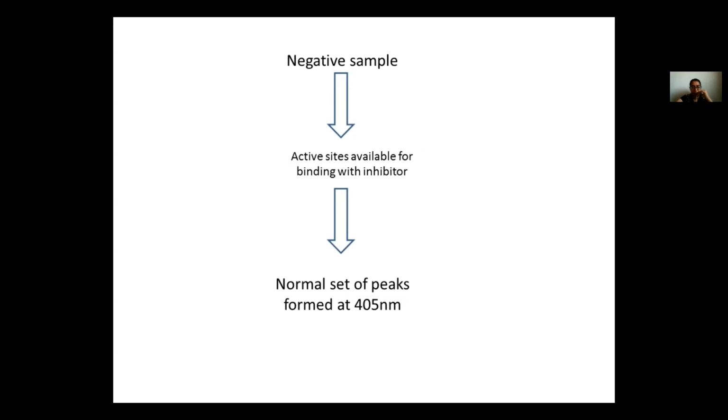It is a very rapid method and can give results in only 5 to 10 minutes, rather than RT-PCR and ELISA, which take a few days to give the results. As you all know, the basic problem for COVID-19 testing is the population. There are a lot of cases, but due to the unavailability of the results or the test kits, it is difficult to check all the people.